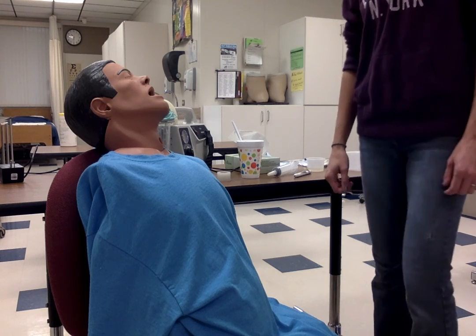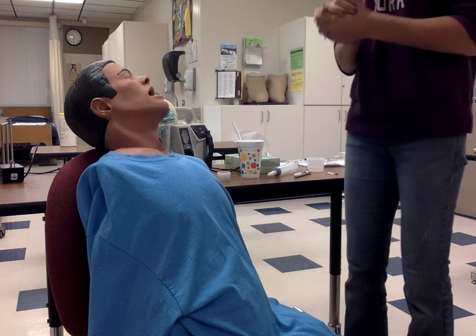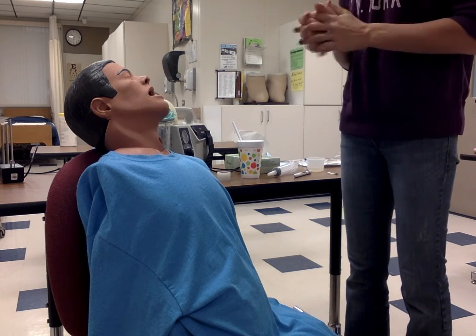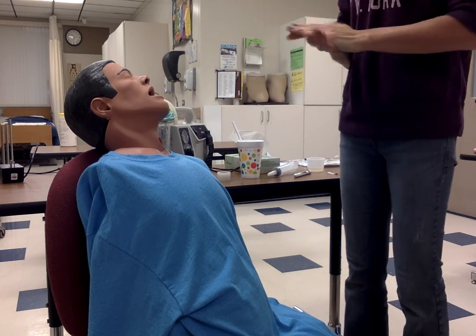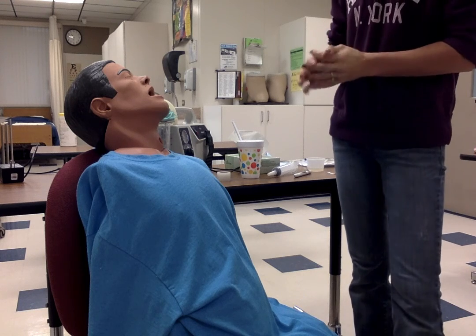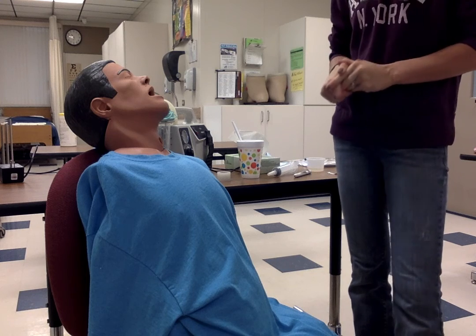Hello, my name is Sasha Thimler, and today I am going to be demonstrating how to insert an NG tube for my patient. So first of all, I'm washing my hands here, and I am going to enter the patient's room, and we're going to start off discussing the order to place an NG tube and some patient teaching that's going to go behind that.